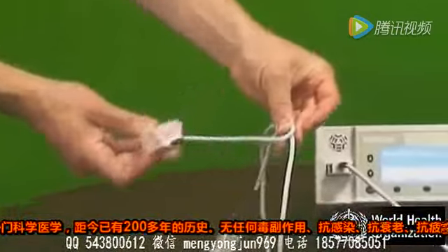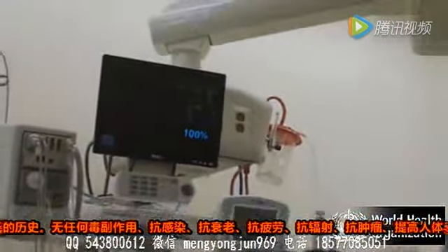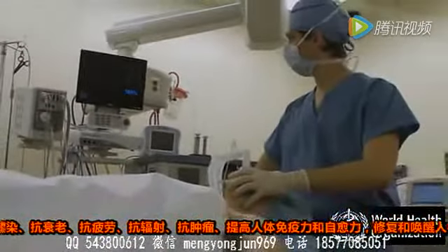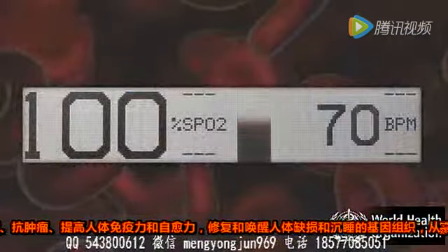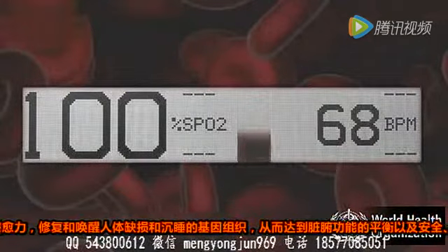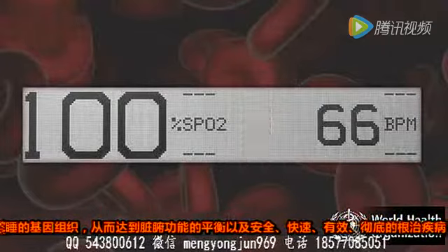During use, the monitor updates its calculations regularly to give an immediate reading of oxygen saturation and pulse rate. The pulse indicator is continuously displayed to give information about the blood flow. The audible beep changes pitch with the value of oxygen saturation and is an important safety feature.